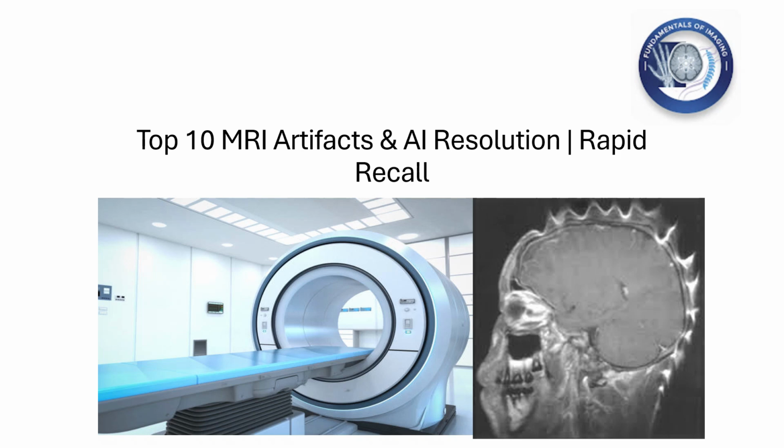Vandana Moiré, consultant radiologist. Today we are tackling a topic that every radiologist, resident and exam aspirant must master, MRI artifacts. These are the distortions that sneak into our images, sometimes hiding pathology, sometimes mimicking disease. By the end of this session, you will know how to recognize them, understand their cause, and avoid diagnostic pitfalls, and the role of AI in resolution of these artifacts.